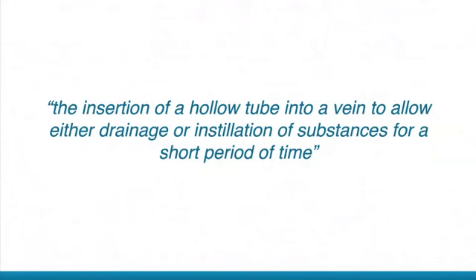We start with an overview of the indications and contraindications of peripheral venous cannulation, assessment of the physical and psychological needs of the patient, choosing the correct equipment, standard precautions, and the anatomy of the cannulation site. The procedure of venous cannulation is illustrated fully, and some of the possible complications are described.